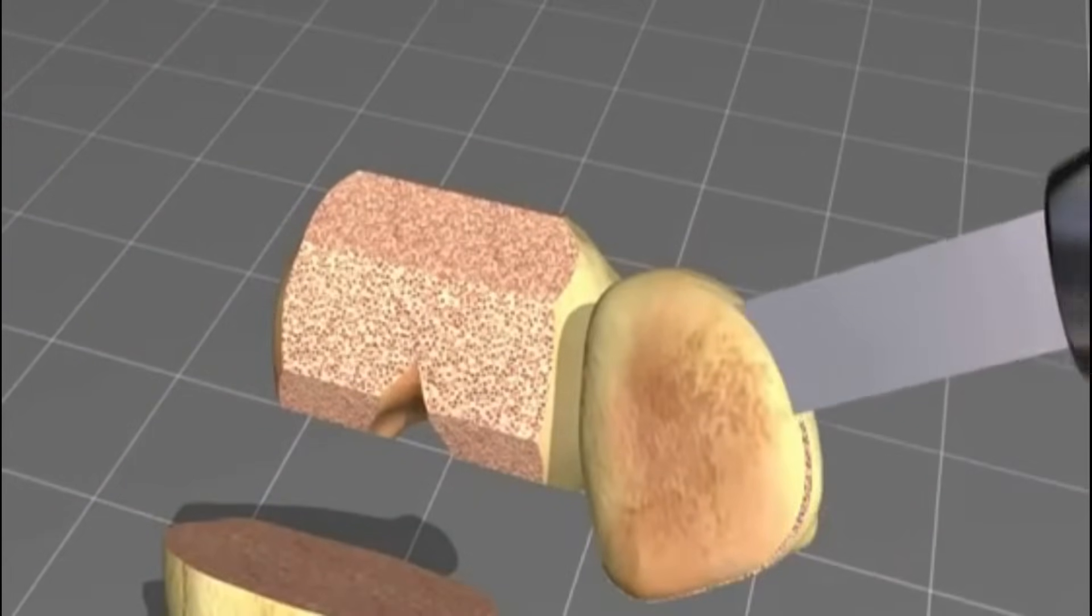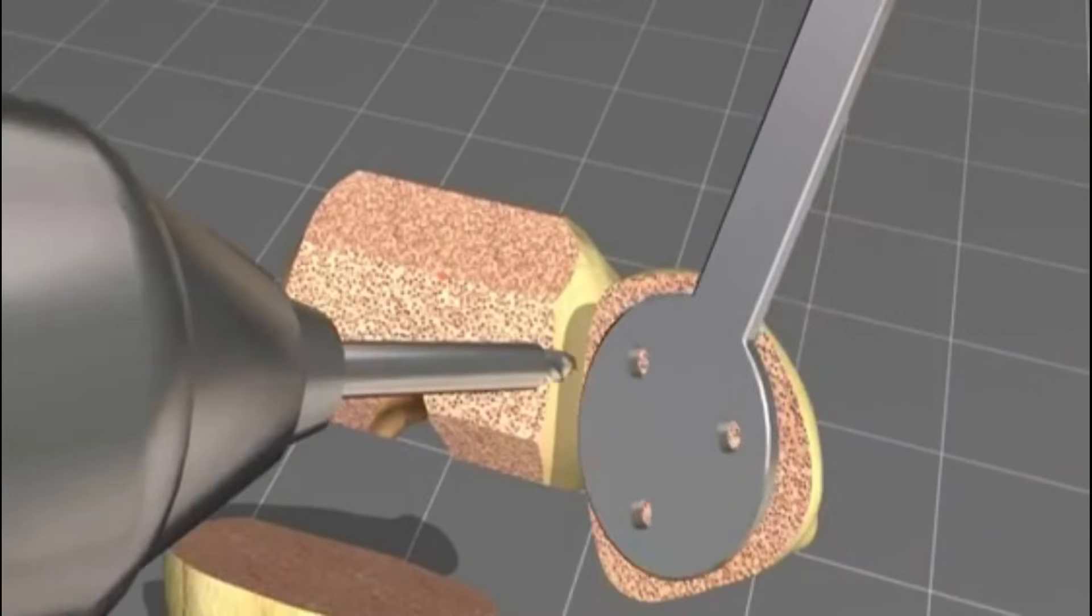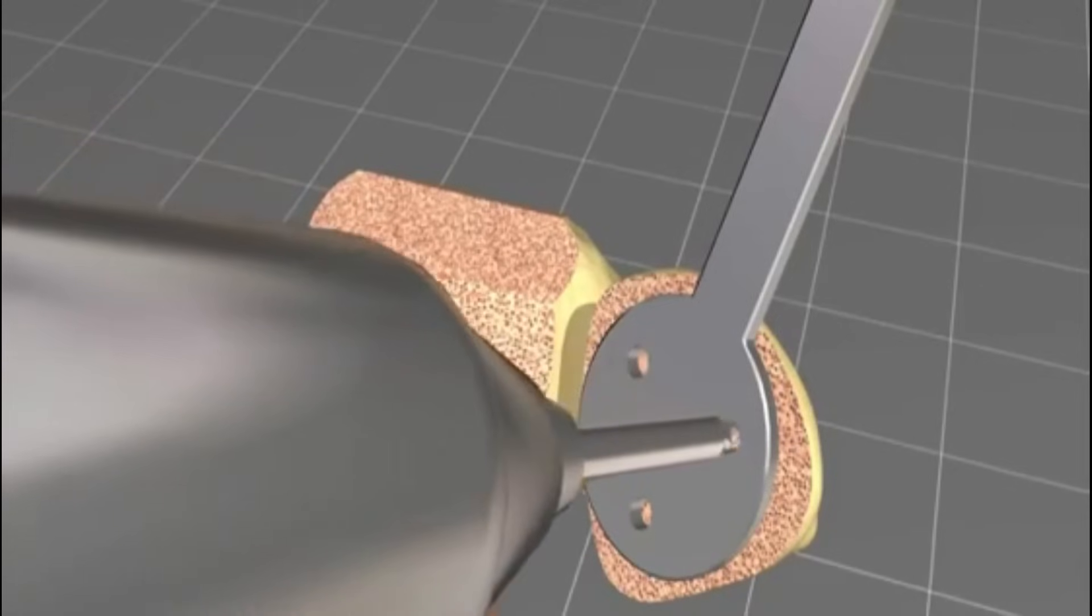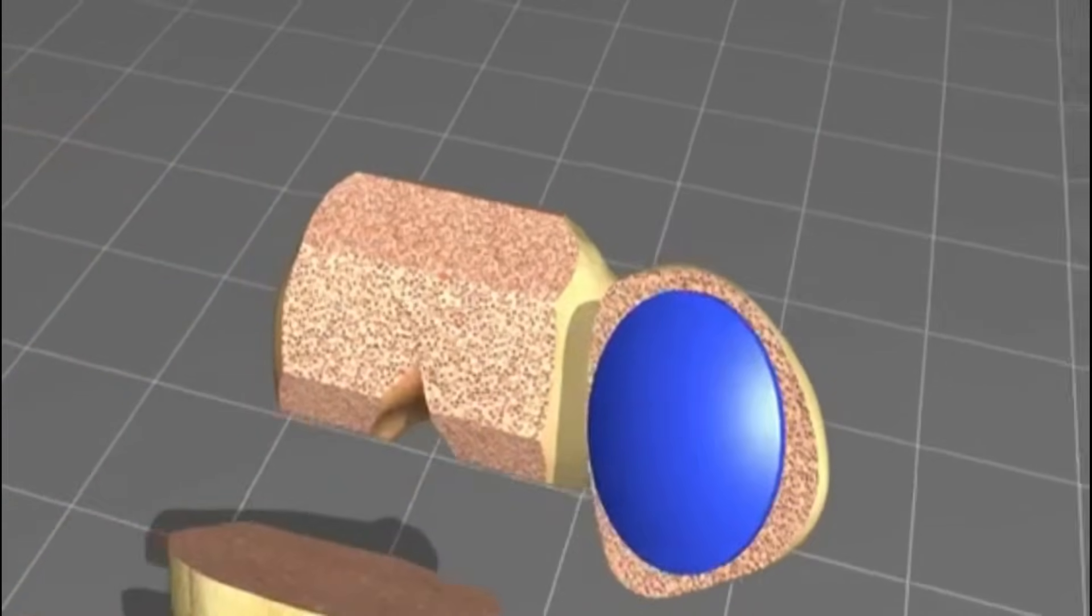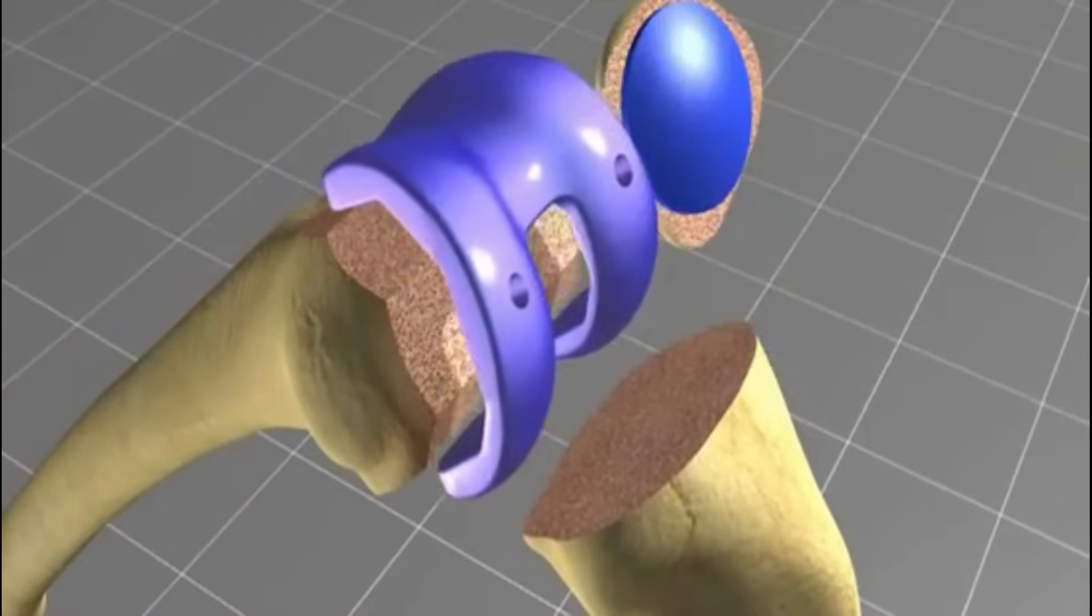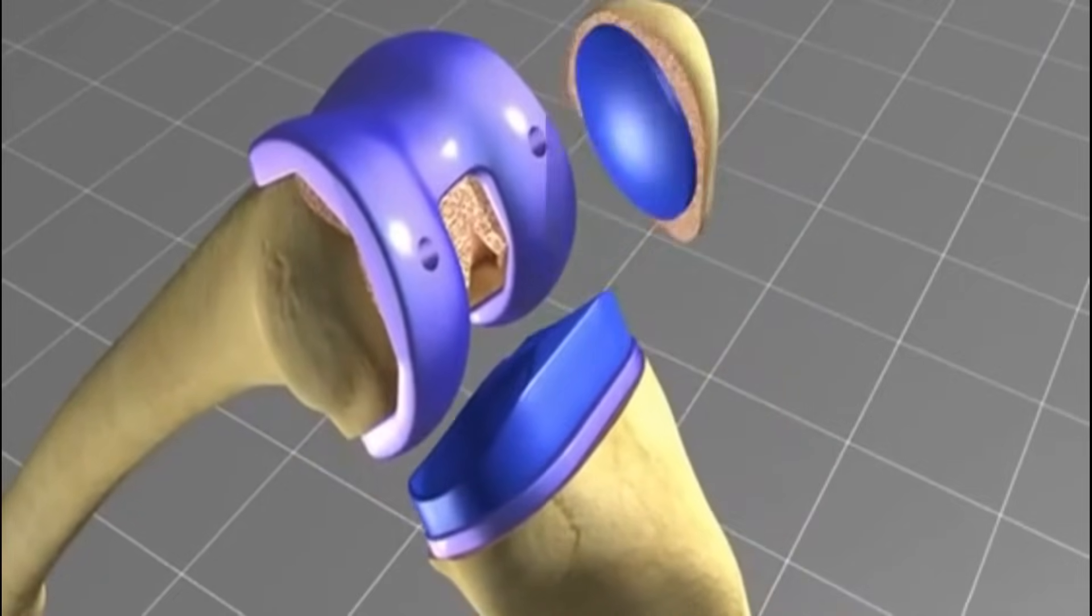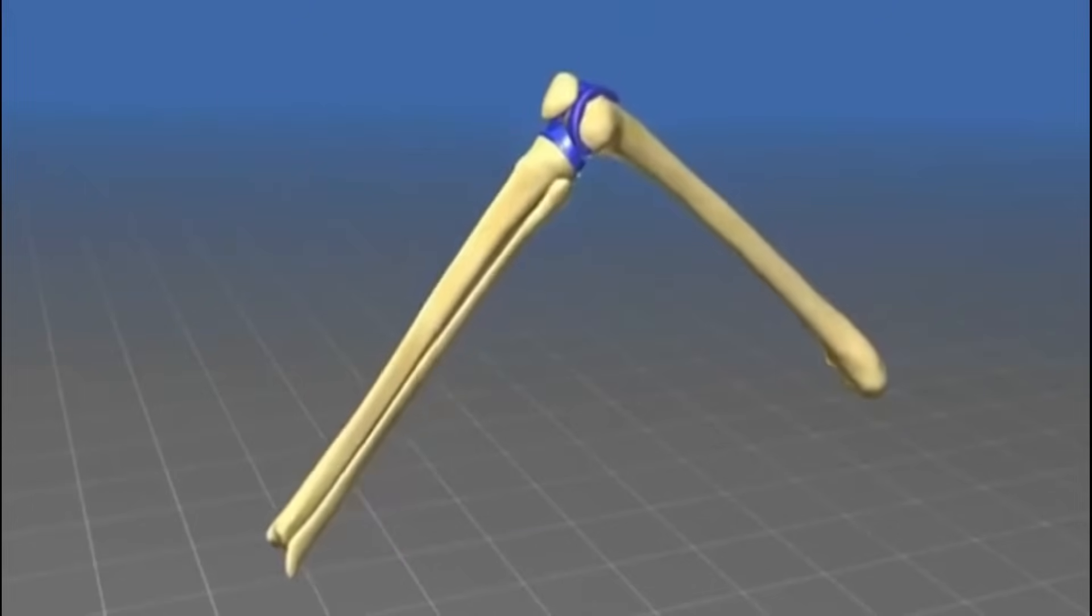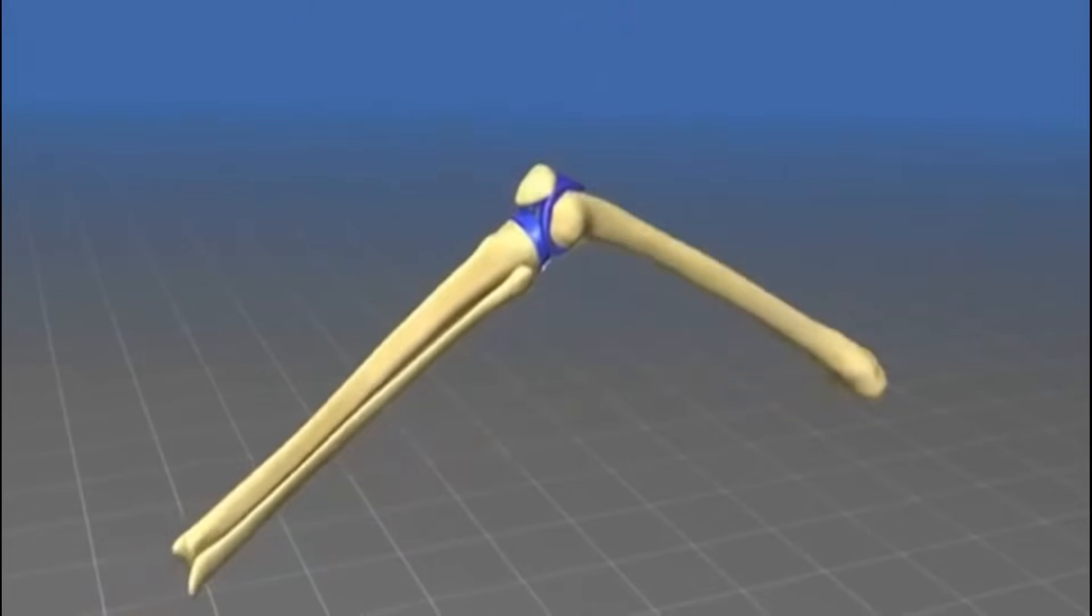In most patients also, the kneecap suffers from osteoarthritis. A small layer of cartilage and bone is removed. There are three anchorage holes drilled into the original bone. The kneecap is covered by a trial implant, as well as the femoral component, the tibial component and a trial inlay. The kneecap is now checked for the range of motion and the stability over this range of motion.